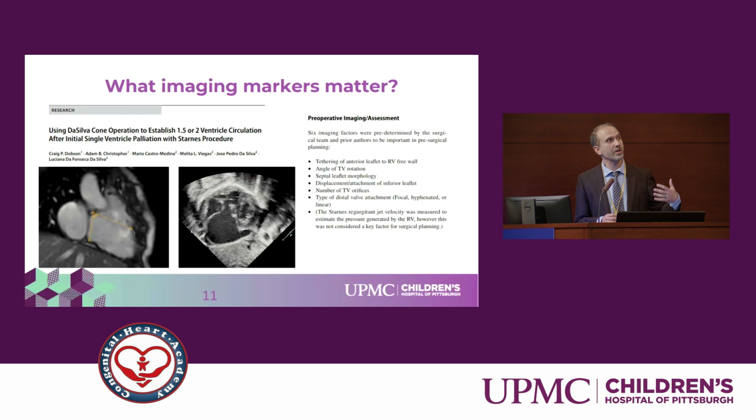But for this talk, I want to focus on the preoperative imaging assessment for these patients. In any patient undergoing the cone operation or cone after Starnes operation, there are some imaging factors that were predetermined by the surgical team and prior authors that are important for pre-surgical planning.